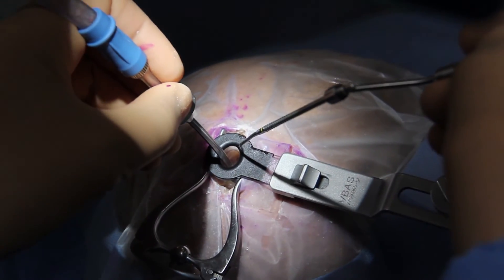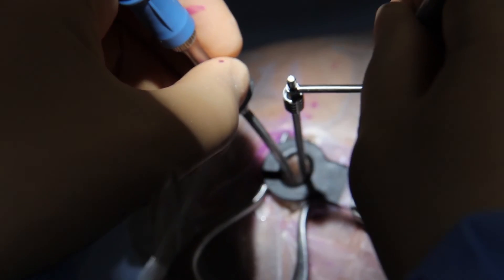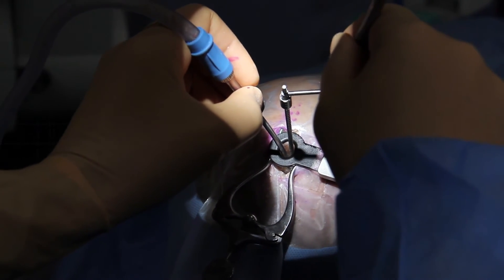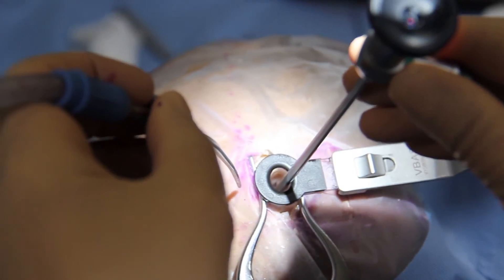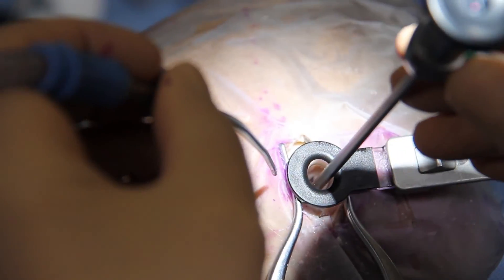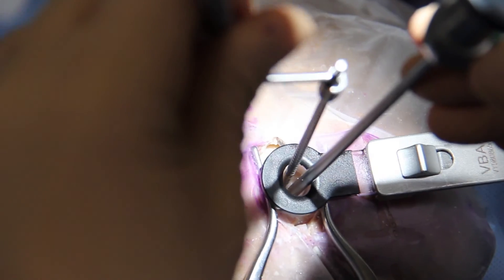Surgical tools are inserted into the working channel and the elliptical shape of the device allows for surgical manipulation and bimanual dissection. Two tools can be simultaneously inserted into the working channel and can both reach the target for optimal surgical manipulation. The endoscope can also be inserted to improve visualization, and the size of the working channel allows simultaneous use of microtools alongside the endoscope.